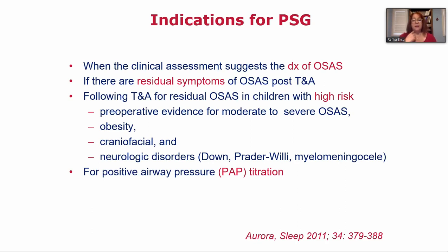independent of the symptoms. This is a little bit questionable, and it was asked during the chat yesterday: do we need to do a sleep study in every child who has obesity after adenotonsillectomy, let's say if the child doesn't have any symptoms? I think in clinical practice, we don't, at least in the centers that I have worked in, but maybe in children with Down syndrome or Prader-Willi, because they may also have some central apneas that remain that may not be detectable with clinical exam or clinical questioning. So those are the children that do need a follow-up study.